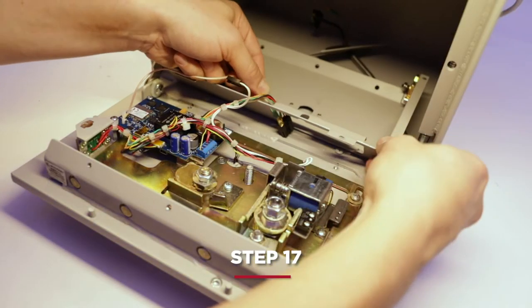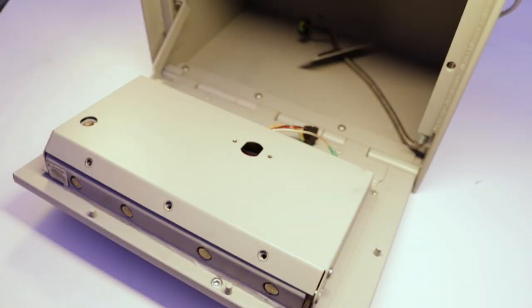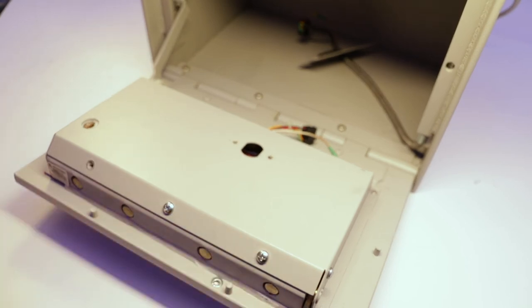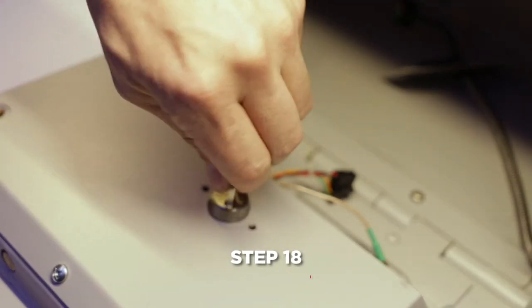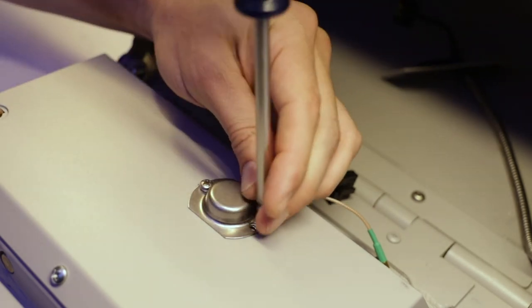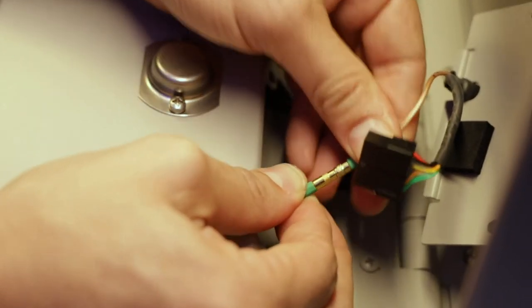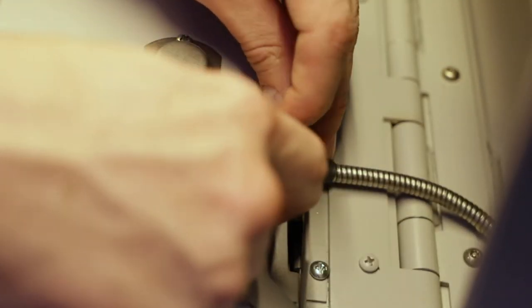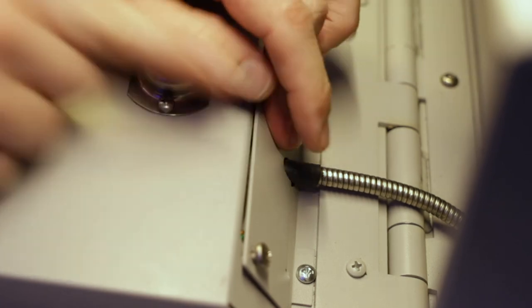Move the antenna cable into the service panel area. Install the tech lock and the tech lock cover. Reconnect the power to the Medvault.